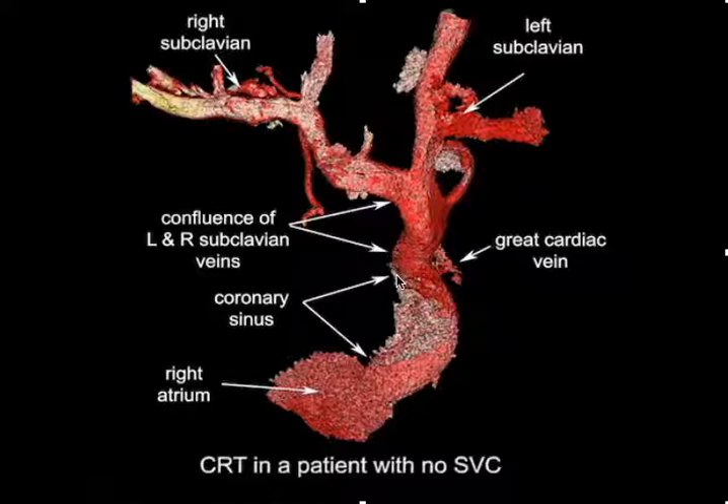Everything below this point is massively dilated and above this point the great cardiac vein is normal in size. Because you can't approach the coronary sinus from the right, this makes it particularly difficult in terms of how to implant your leads.